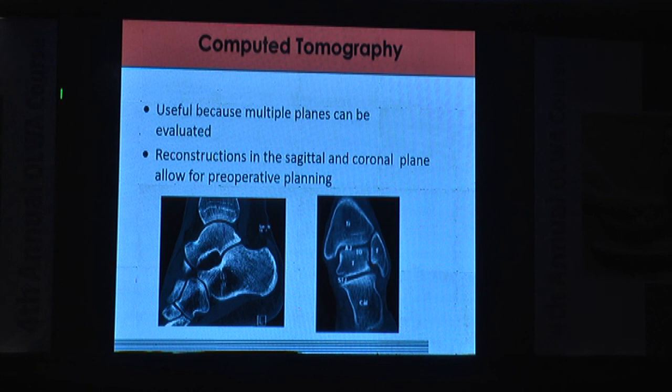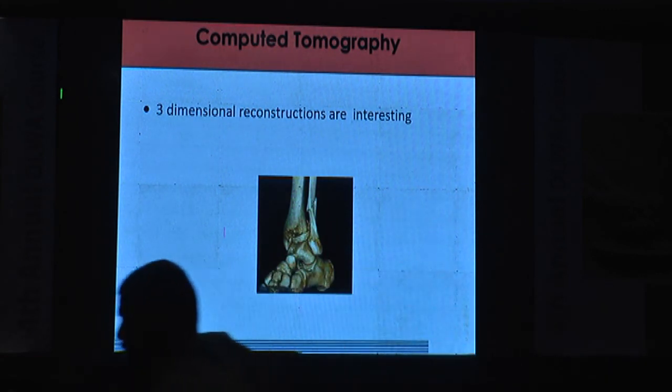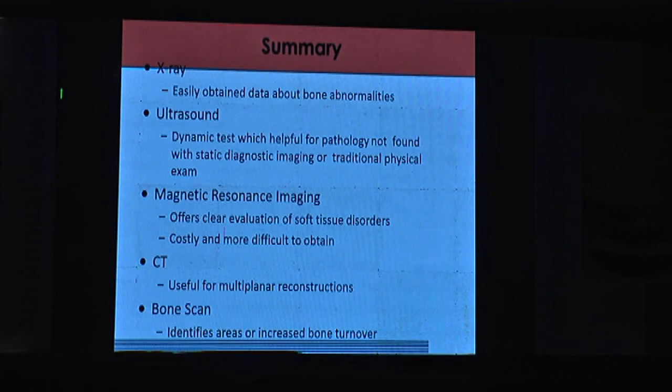A number of applications. For the sake of time, I have omitted a lot of slides from here, but we all know the indications of CT, especially in fractures. 3D reconstructions are really helpful. So I'll rest my case here. Bone scans sometimes are helpful.